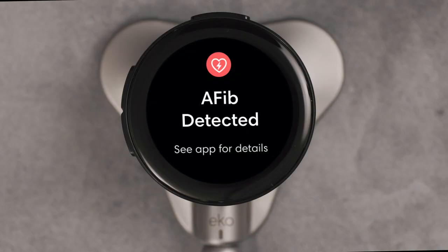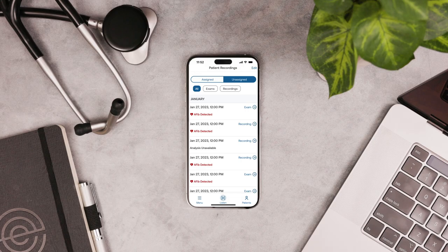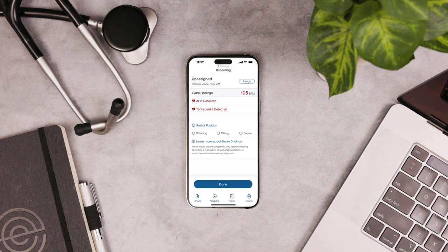If you have AI Analysis turned on, you'll see the results right on the screen. You can review recordings in the ECHO app — they're all saved in the unassigned section of the patient screen. From here, you can assign them to patients.